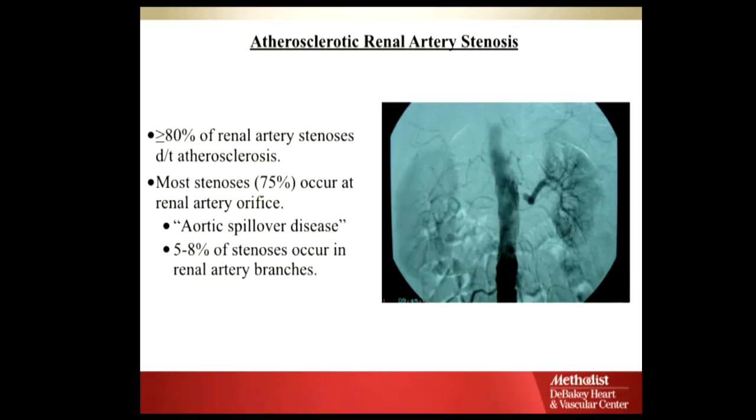So for this type of problem, right? You don't want to put a balloon expandable in the SFA, because you're running and you're going to move, you might crush it, right? So you put self-expanding in the SFA. Same thing for the carotids. The reason we don't do balloon expandable in the carotids is that if you have a fight with your spouse or something like that and she chokes you, you might shut down the stent. But if it's self-expanding, hopefully it will re-expand again and it won't be an issue.